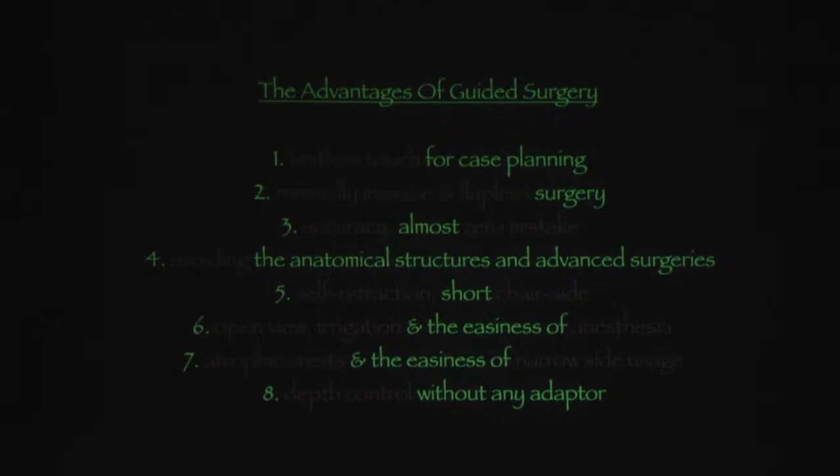Avoiding the anatomical structures and advanced surgeries, which is very important for us in our private practice, because the patients prefer your clinic with this option because they have fears about surgery. And the fifth one, the self-retraction and short chair side time, which is very important. I will show you some photos, and there is no need to get an assistant, no need to make any retraction. Your assistant will help you in other things, not retraction.